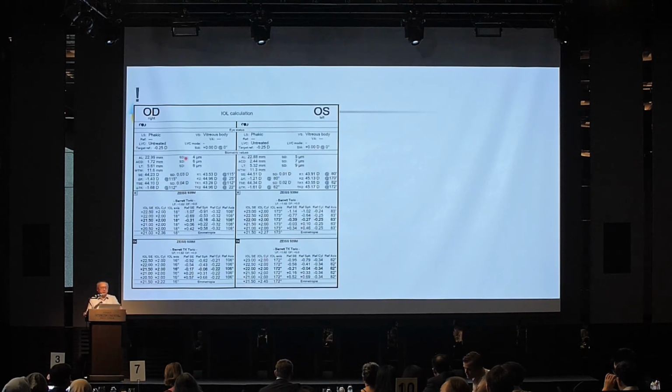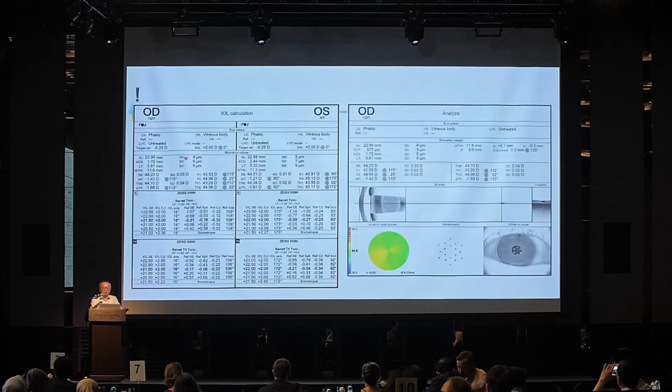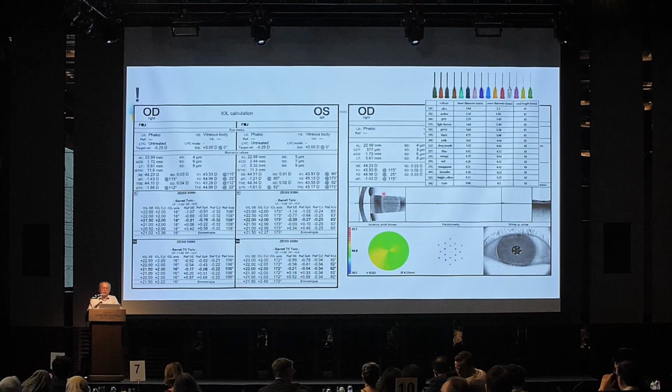On the slit lamp you may see, but here you want to know, because if it's so shallow, then you have to ask yourself, with the phaco tip, do you need to make special allowance for this shallow ACD?